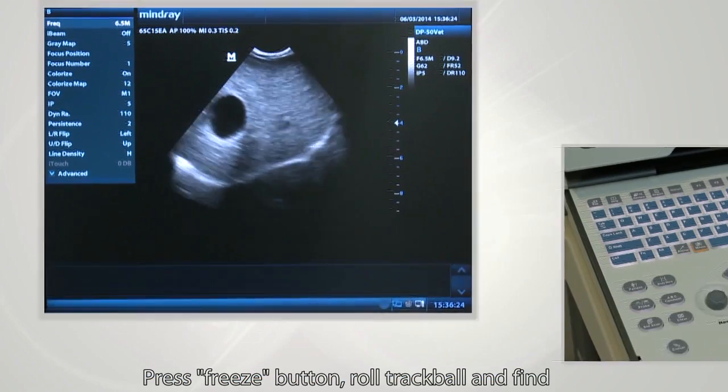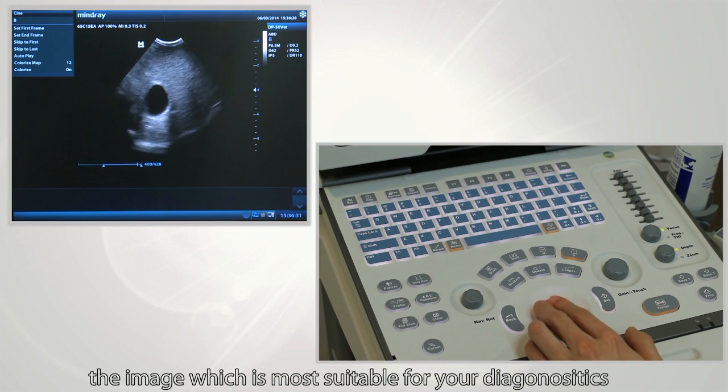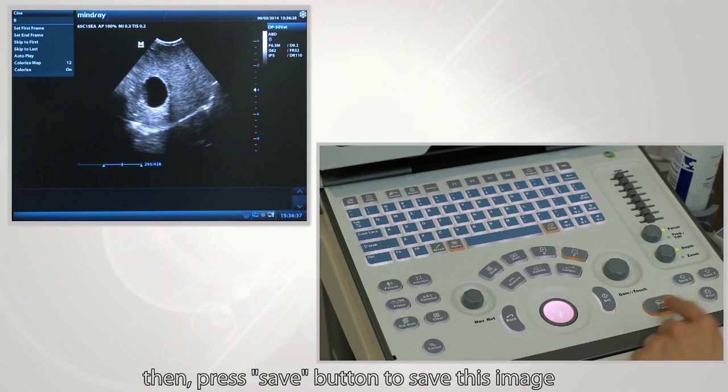One such parameter is the freeze feature. Press the freeze button, roll the trackball, and find the image most suitable for your diagnostics. Then press the save button to save this image.